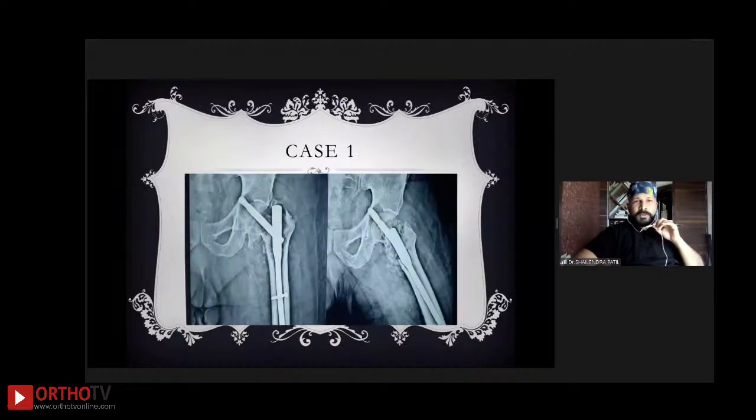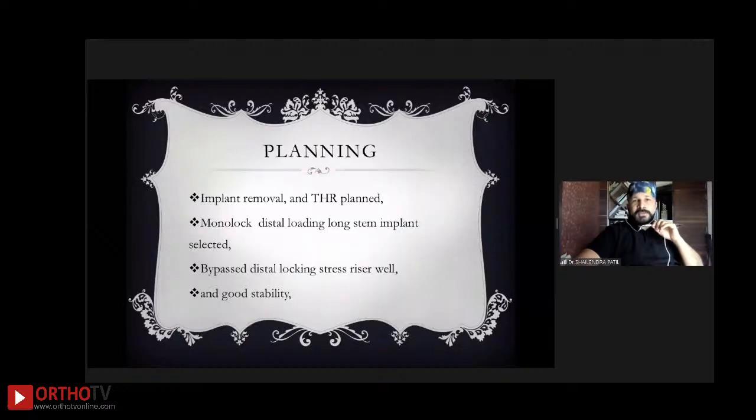The patient was happy and moved around, and then had another fall at home, and he came with this kind of x-ray picture. We admitted him and investigated him. It was difficult to get medical fitness for him, but still we managed. The planning was implant removal, so we asked the primary implant company for the extraction removal set, and we planned a total hip replacement.